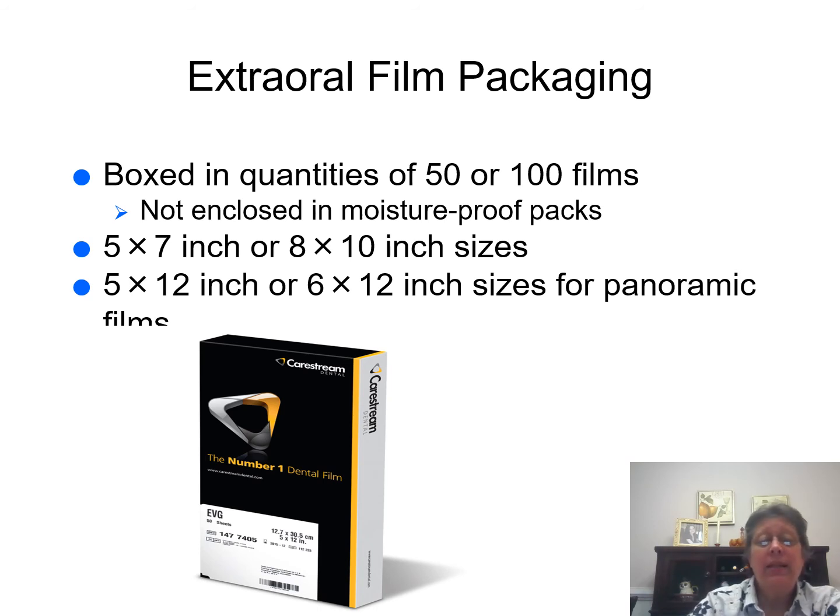But this film is also light sensitive. So this film has to be loaded in a cassette or a vinyl pouch that we'll look at in just a minute. And it has to be loaded in a dark room. If you open this box and say there's 50 film in here, and you do it in white light and not in a dark room under a safe light condition, you will expose all 50 film and ruin all the film that's in this package. So this has to be opened in a dark room, and then the lid put back on the box before the white light is turned back on.